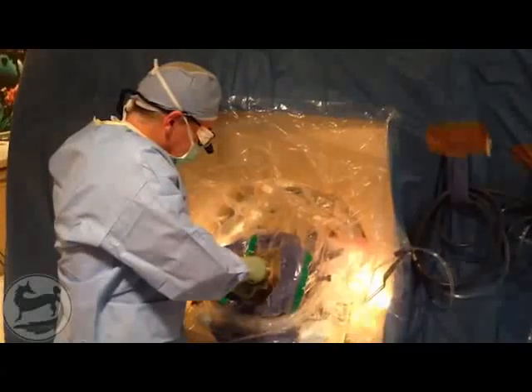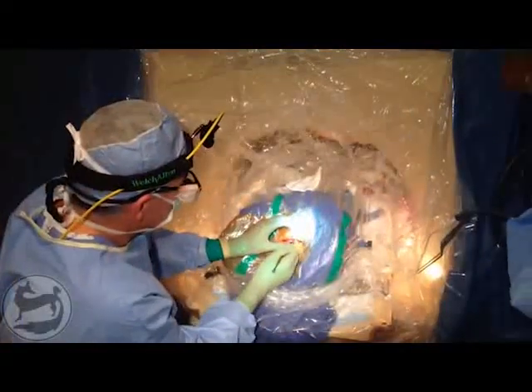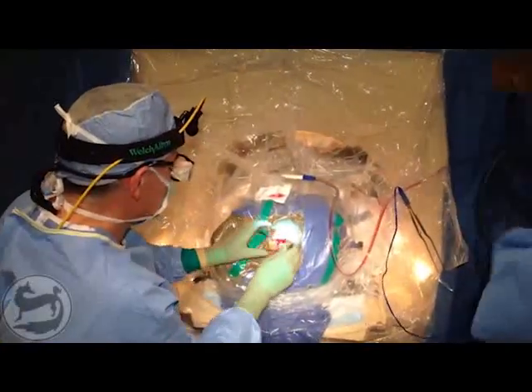The incision is marked and opened with a surgical blade. Periosteum is bluntly dissected, and hemostasis is achieved with bipolar cautery. After a retractor is positioned, a borehole is created with a cutting drill.